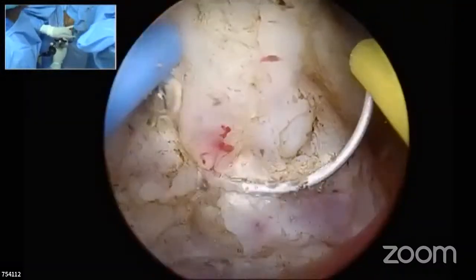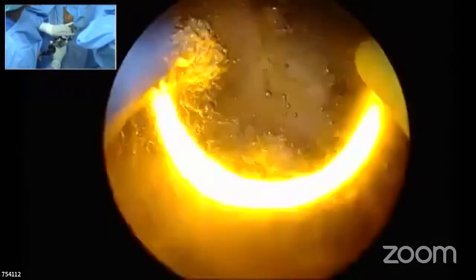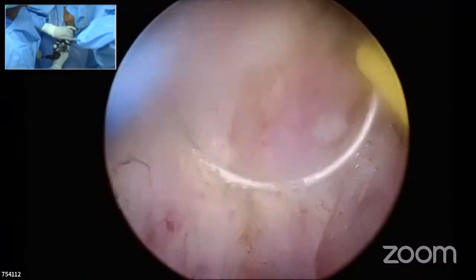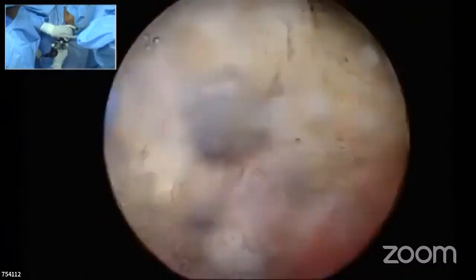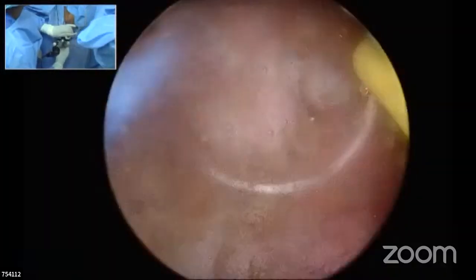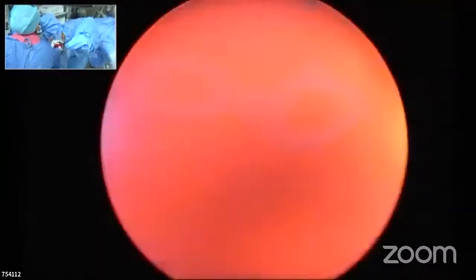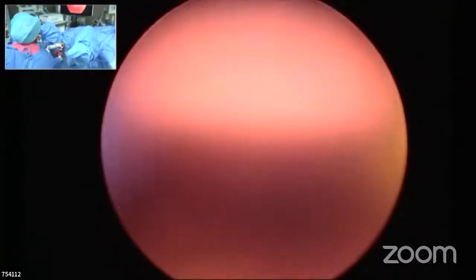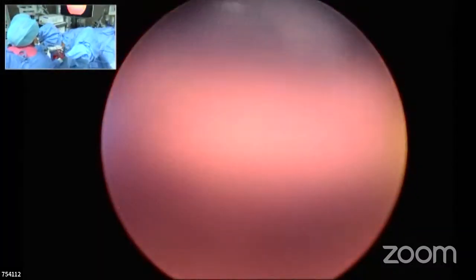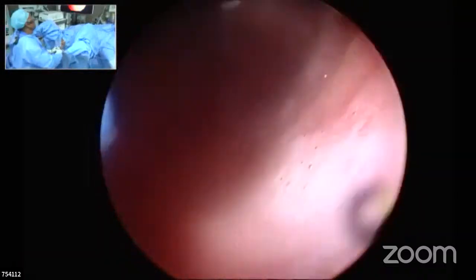The artery of Flocks is a very definite structure that you see at 11 and 1 o'clock. Yes, sir. And that's the one which has to be taken care of. The commonest cause for a secondary bleed or a post-TURP clot retention is that. So finally, looking at 11 o'clock and 9 o'clock at the bladder neck, the junction of the bladder neck with the adenoma is the area that has to be taken care of.